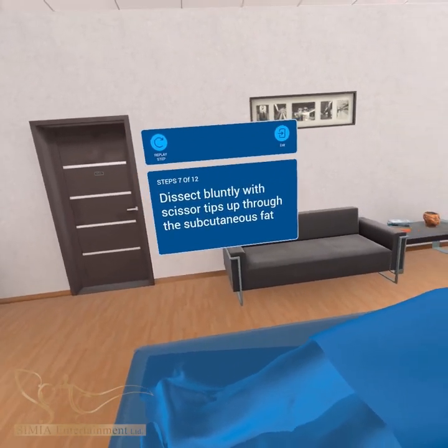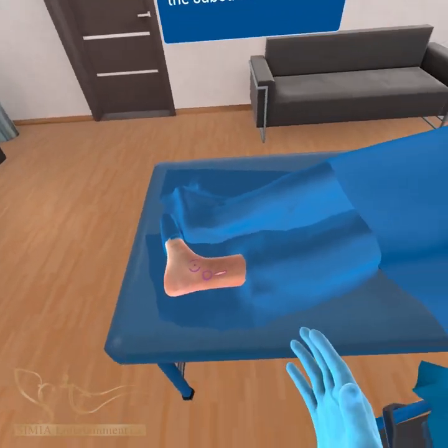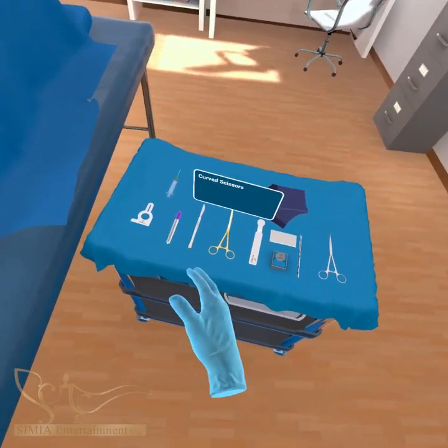Dissect the subcutaneous fat bluntly with scissor tips pointed up. There should be no use of sharp dissection in this area.